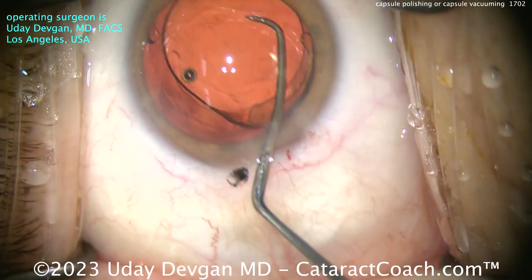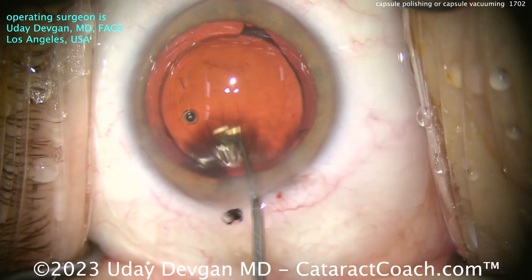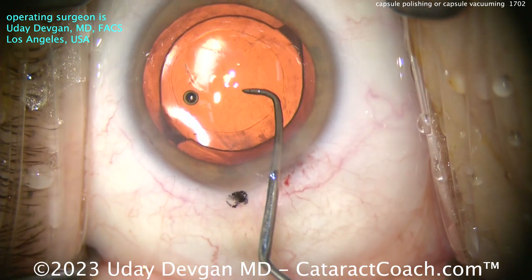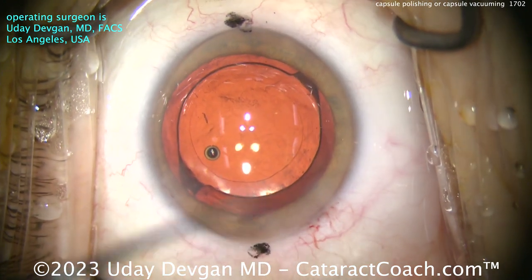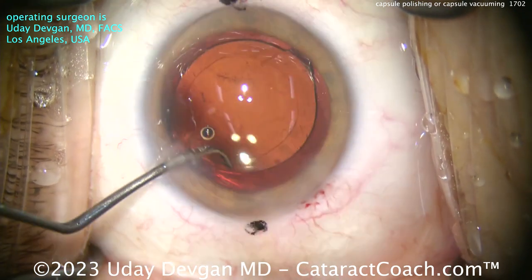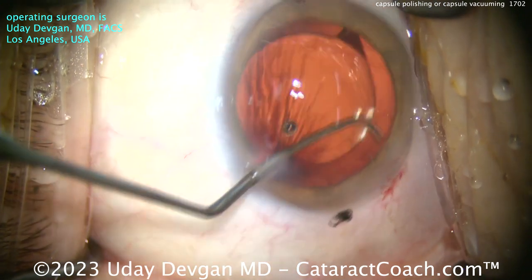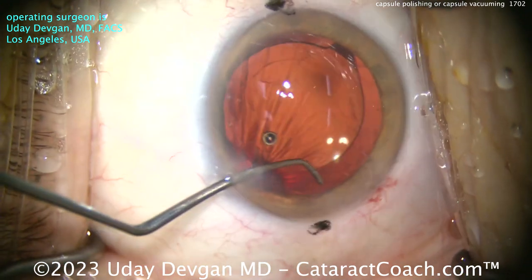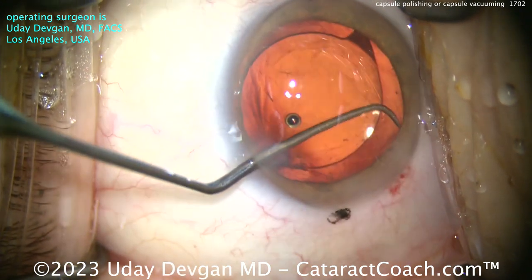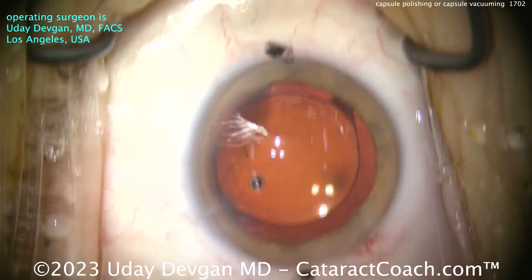Here's the lens in the capsular bag — you can see a nice-looking rhexis overlapping the optic 360 degrees. Get that rotated where we want it. Now when I put the IA probe in the eye, I can actually vacuum and clean that up. Here I'm using the chopper to work the sub-incisional space — you can polish with the chopper; you don't need a special instrument per se. This chopper I've designed has a flat tip that can be used to polish if you think that's helpful.